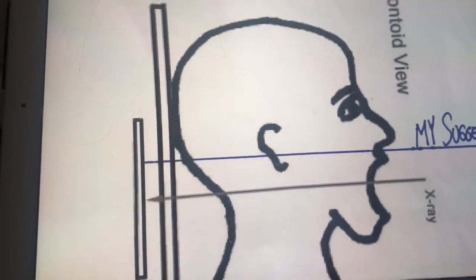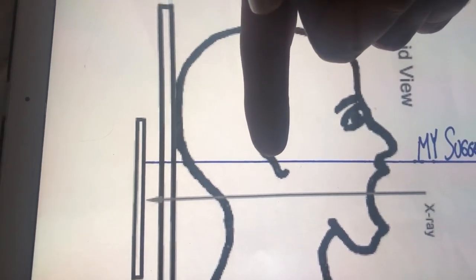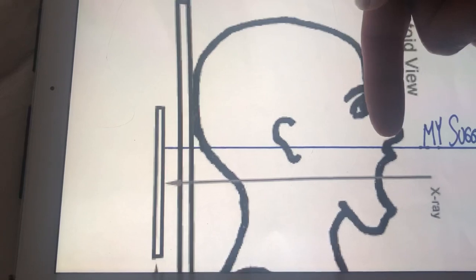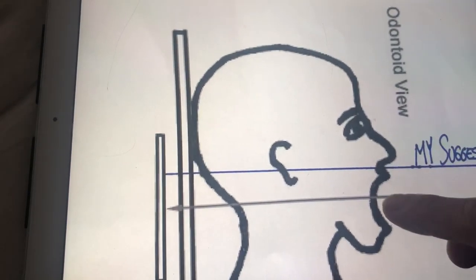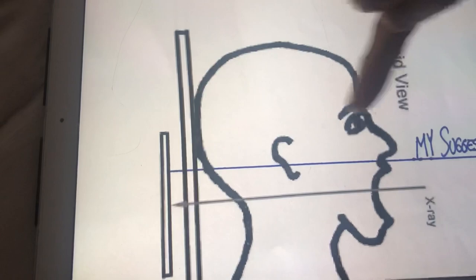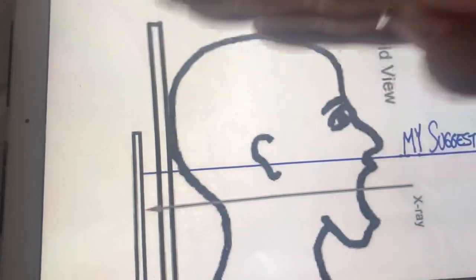You find the bottom of the nose where it hits the upper part of the lip, and you find the EAM, or the ear hole. You line up your central ray so it goes right through here and bisects the EAM. After you do that, you bring it down to the crease — it's a simple tube adjustment up and down. You keep their EAM and the bottom of the nose where it intersects the top of the lip, and you'll nail it every time.